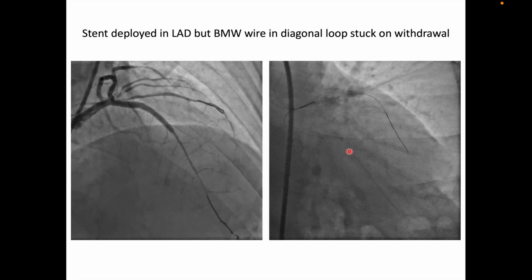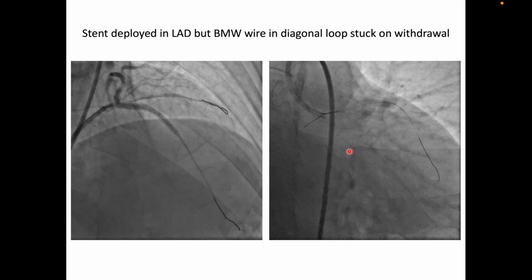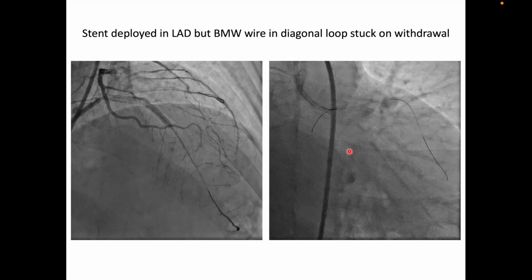So after I put a stent into the main LAD and I'd taken the final picture, I wanted to remove my BMW wire. I was a bit casual.